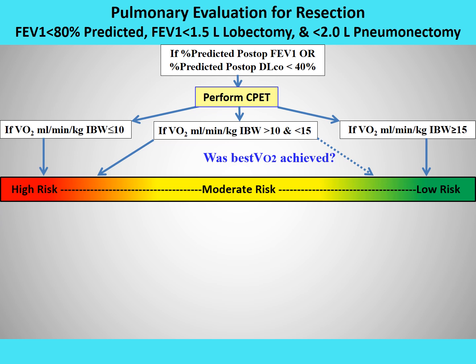I firmly believe that cardiopulmonary exercise testing should only be supervised by those with experience, who are aware of the subject's predicted pulmonary and cardiac limits to be able to recognize when a patient has performed an optimal test rather than quitting due to discomfort from lack of regular exercise. Some of the tools that cardiologists use in interpreting exercise tests, we could also utilize in interpreting pulmonary exercise tests assessing a patient's effort, which we will discuss next.